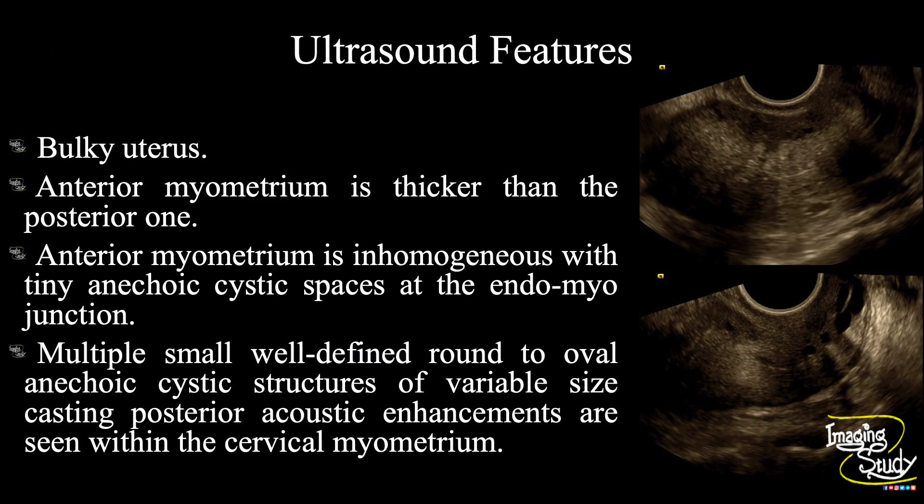In summary: the uterus is slightly bulky; the antero-myometrium is thicker than the posterior one; the antero-myometrium is inhomogeneous with numerous tiny cystic spaces seen at the endomyo-junction; and multiple small well-defined round to oval anechoic cystic structures of variable size casting posterior acoustic enhancements are seen within the cervical myometrium. These features suggest a case of adenomyosis with cervical Nabothian cysts.